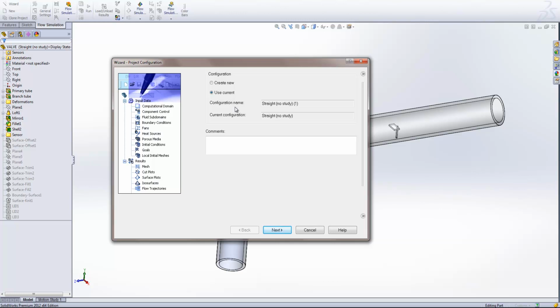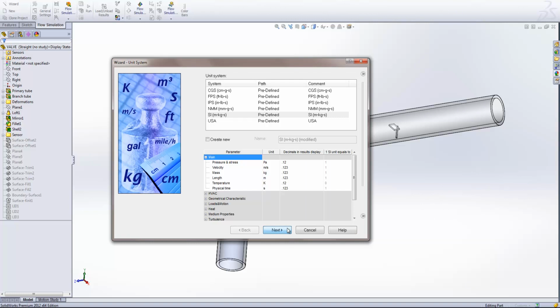We could, by all means, if we wanted to run a number of different studies on the same thing, just keep generating new configurations from here, giving it a name and attaching a new study to each of those configurations. In this case, we're just going to use current.